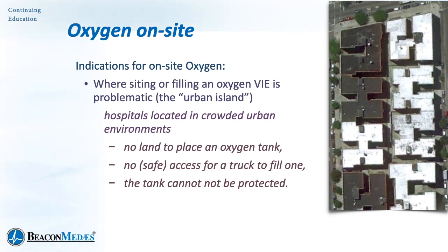One of the more interesting ones is what's called the urban island. The urban island is all about the situation where the hospital's built up the site that it occupies to the point where it doesn't have anywhere that the truck could go park while it was filling the big white tank, or in fact no place for the big white tank to go which is safe. So now what do we do? How do we deal with that oxygen need?